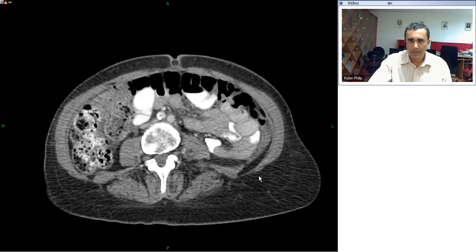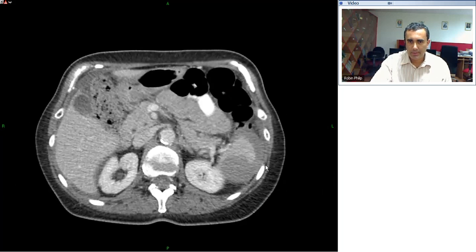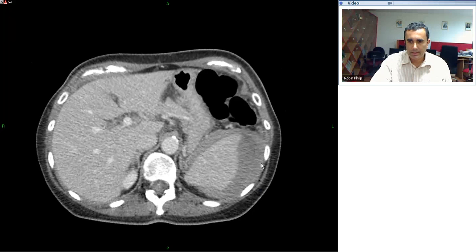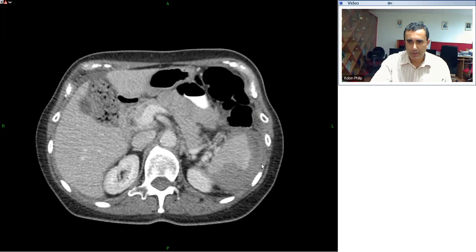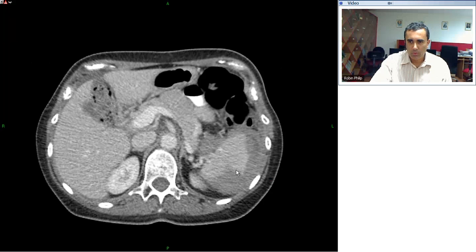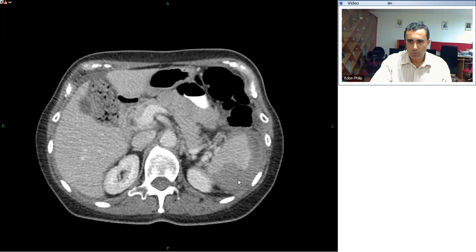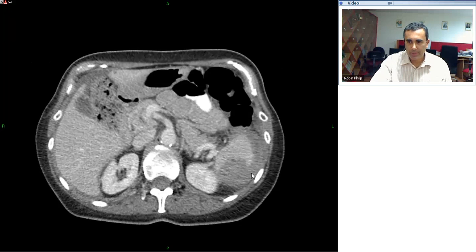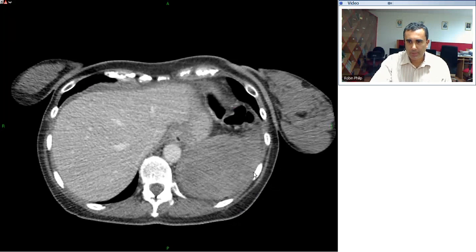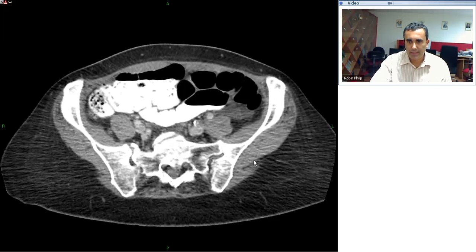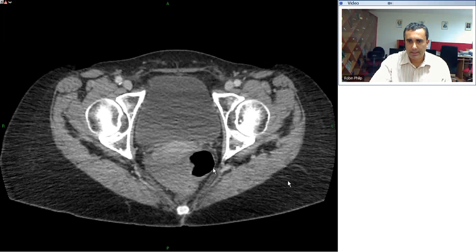Putting it all together in a patient who has undergone recent colonoscopy, this is a case of splenic rupture. You can see the hematoma that has developed in the spleen, which has ruptured through into the subcapsular space, then through the splenic capsule into the subphrenic space, and has tracked down through the peritoneal cavity resulting in hemoperitoneum.